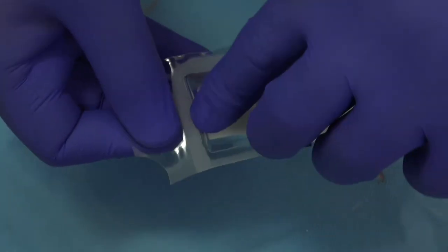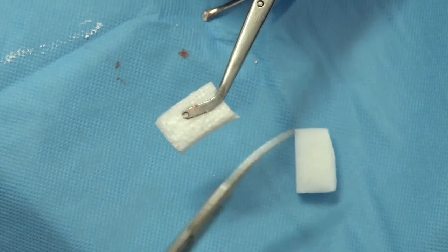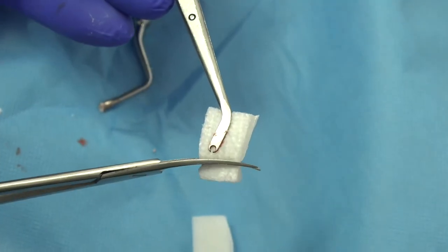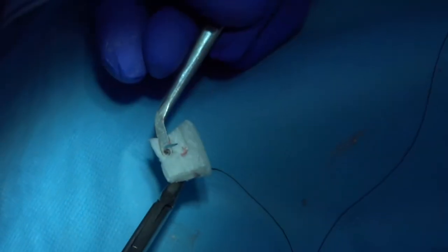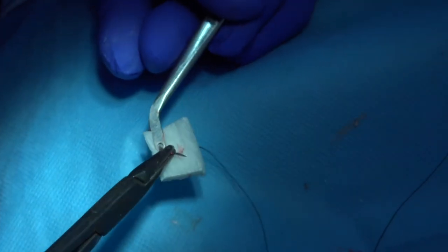Here is the collagen sponge — a simple one which is not expensive. The only thing you need to do is trim it a little bit. You shouldn't adapt it. The only thing you need to do now is suture it and secure it in place.